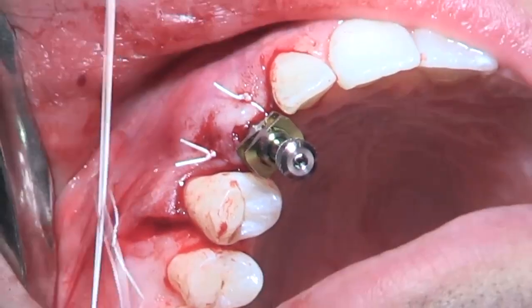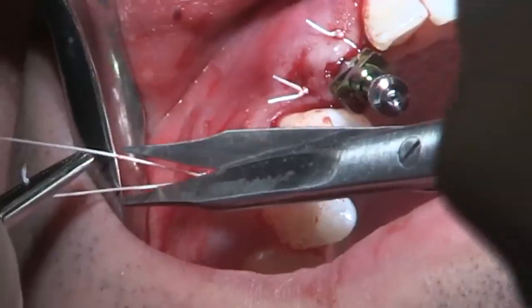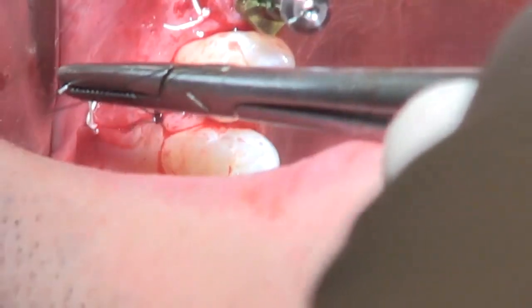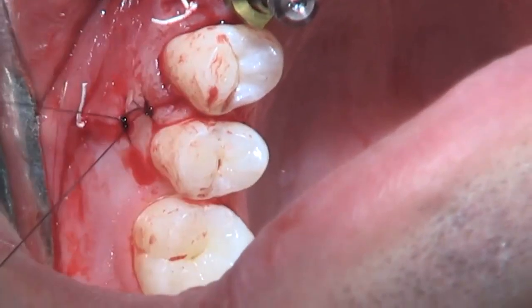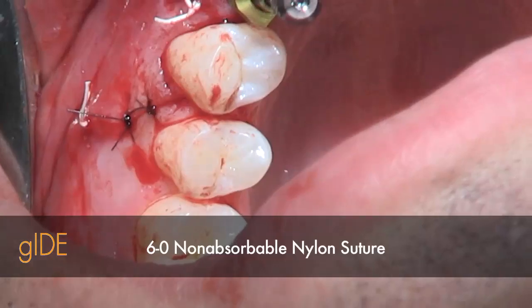Also, the vertical incisions are being closed, and some of these sutures will stay as the final sutures, and some of these sutures will be removed and then replaced after the impression coping has been removed. The final sutures in the papilla area are 6-0 nylon sutures.